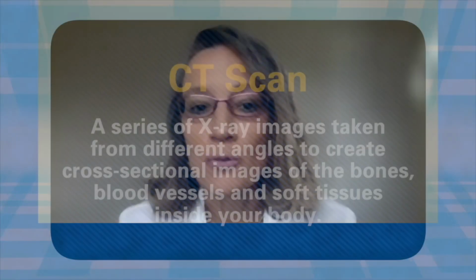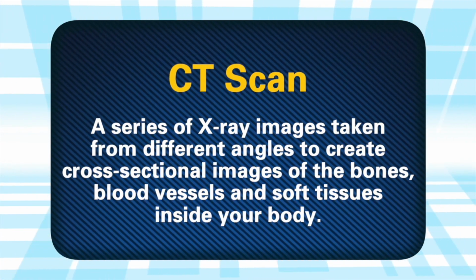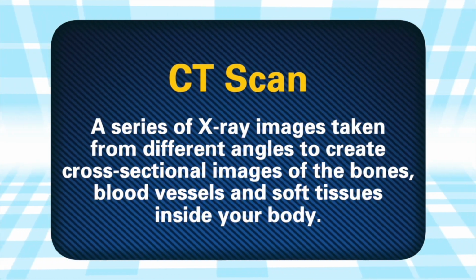So in terms of lung cancer, there's one test that's offered for screening for lung cancer, and that's a CAT scan, or you might have heard it called a CT scan. And it's a very simple test. It doesn't require being poked with a needle to start an IV. It doesn't require drinking any contrast material, which individuals may have had to do for an abdominal CT. It's a quick test that takes about 5 minutes, lying on a table, passing through a donut-type piece of equipment. That's how the CT scan is done.